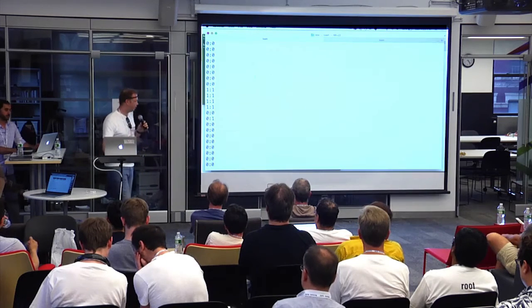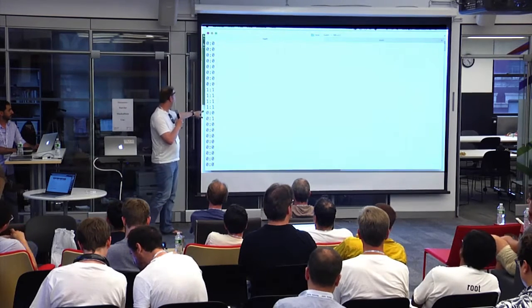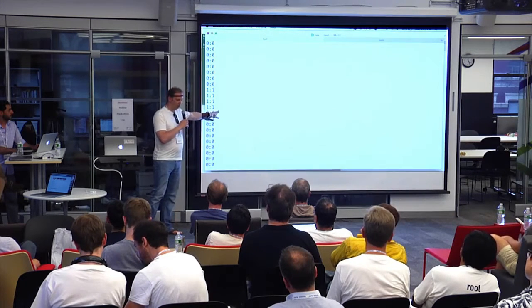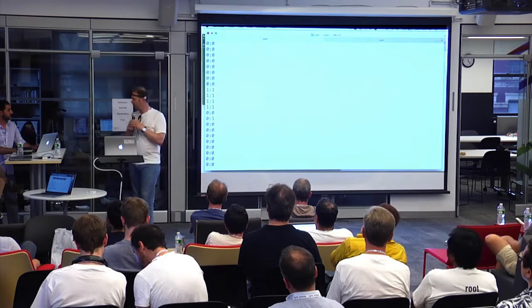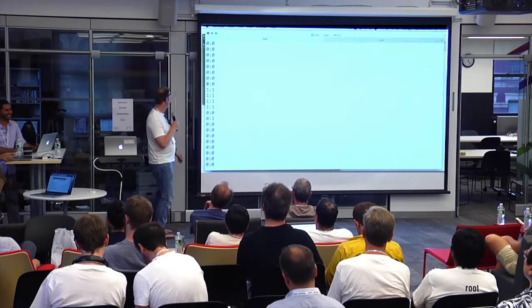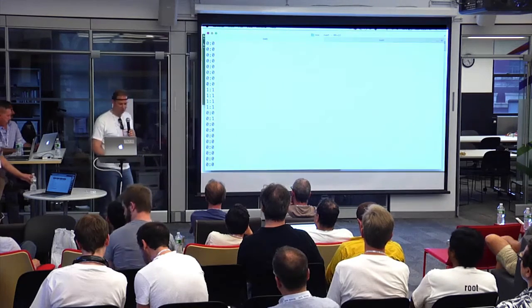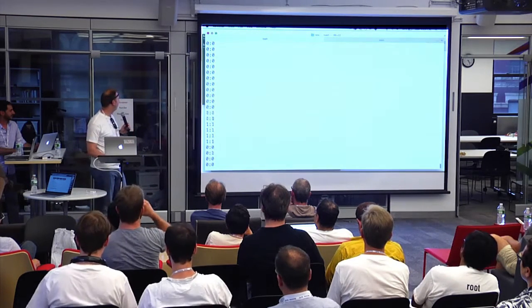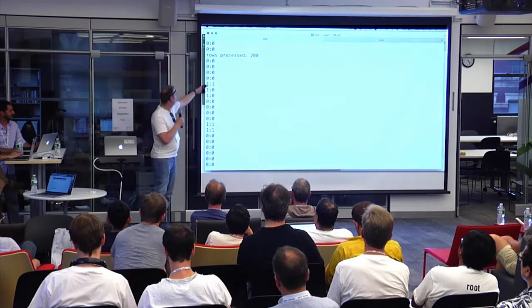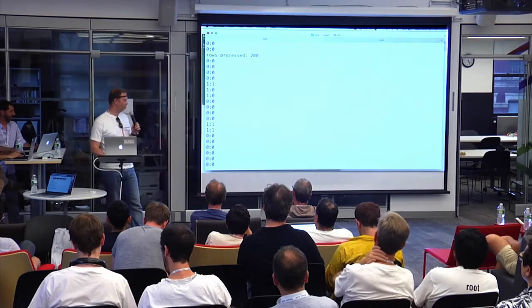And so we downsampled to average over 10 samples. On the left side is the HTM predicting whether you blinked, and on the right side is our existing algorithm. Oh, it's vice versa? Okay. Reverse what I just said. So this is the HTM, this is our existing algorithm. So it seems to be doing pretty well. It's only mispredicting occasionally. Here we have some mispredictions, but most of the time it seems to be working pretty well.